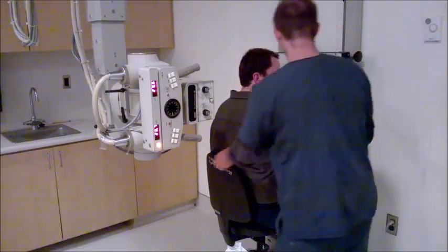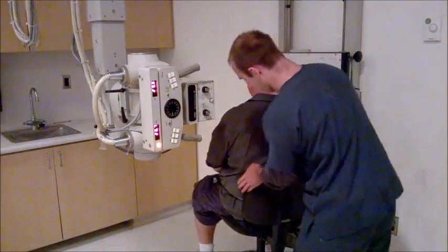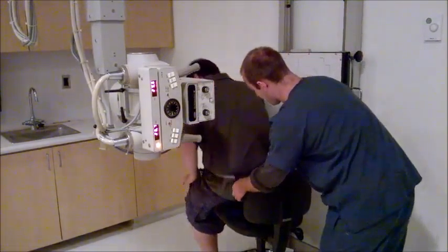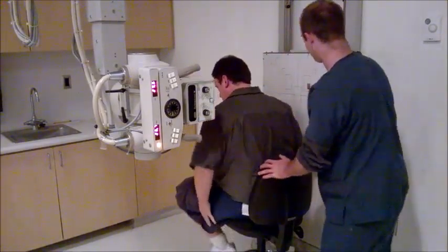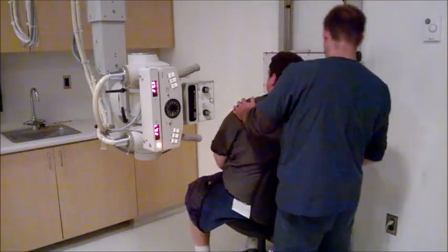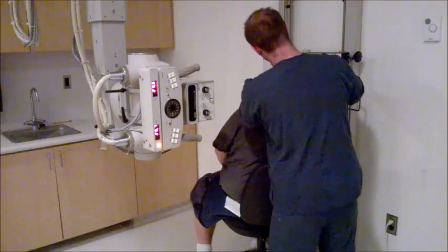The next one we're doing, we're going to have you go around. There we go. And now adjust your shield. Actually get up a little bit and adjust your shield to the left side. There we go, sir. Just to protect yourself. Keep going. That's all right. So now bring your right side as close to the board as you can. Bring your chin right there.